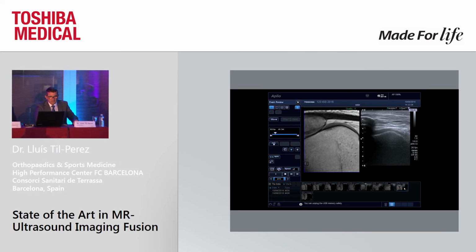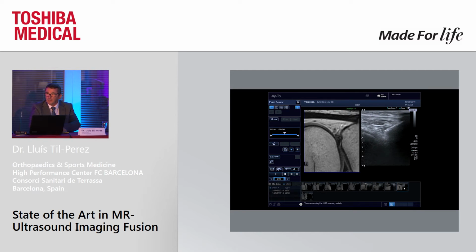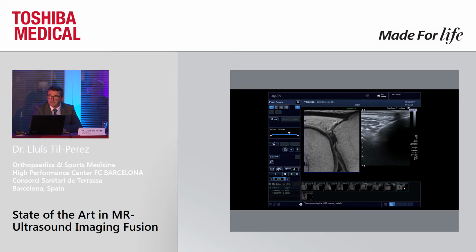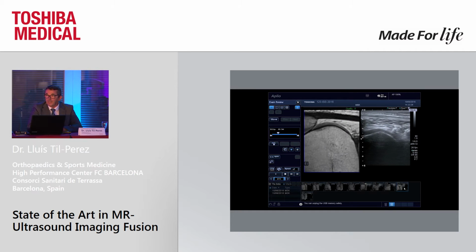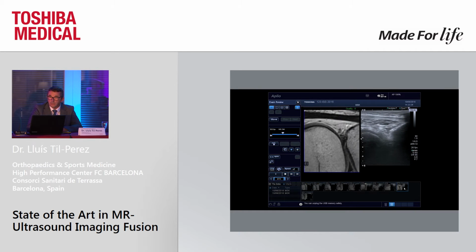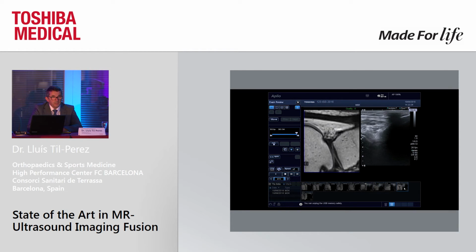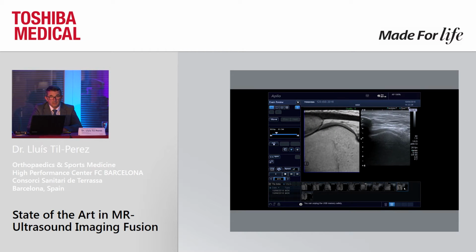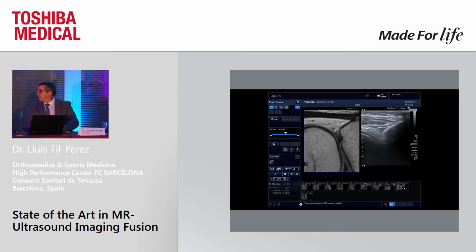I want to talk to you about our experience with fusion technology with MRI and ultrasound, especially for sports medicine. You can see the fusion in the image now. When you are doing fusion, you are navigating within the MRI in real time, and it could be very useful, especially for teaching purposes and also for injections. Please, the presentation, Marco, Peter.